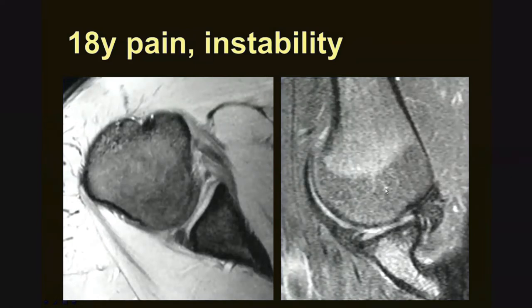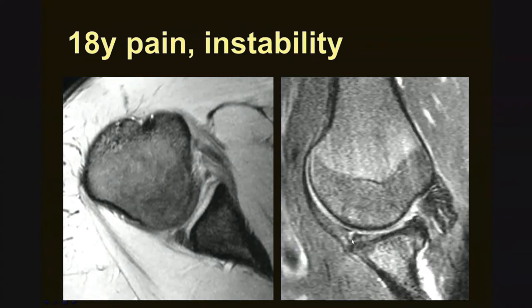We don't frequently obtain an ABER image in a non-arthrographic study, but in this case we did. This thickening represents the joint capsule. As we go more caudally, notice how fluid is present within the labrum. This is one labral fragment; here's the other labral fragment attached to the adjacent cartilage. The IGL is attached to a labrum that's torn and therefore is incompetent — and that is what's associated with the instability in this particular case.